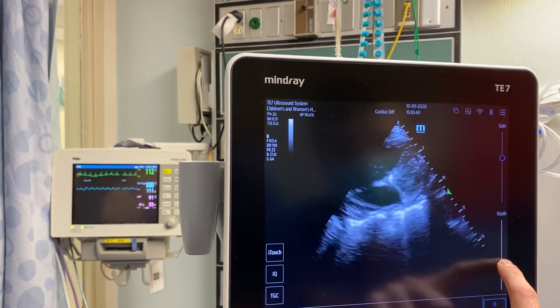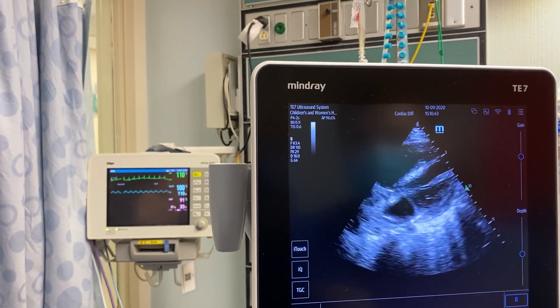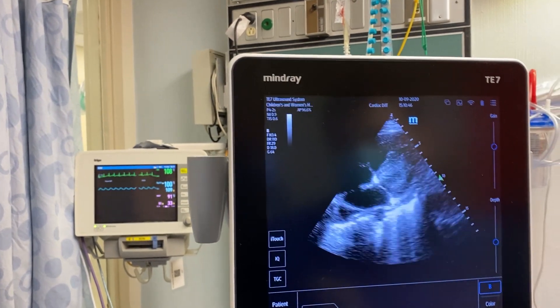Look in apical four. One second. That's looking good.